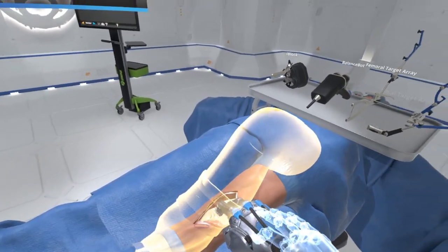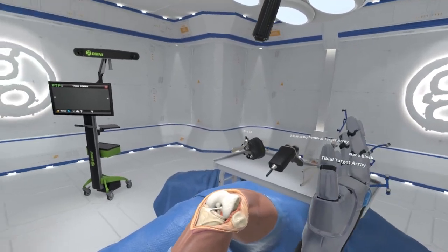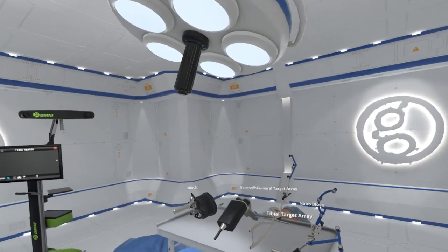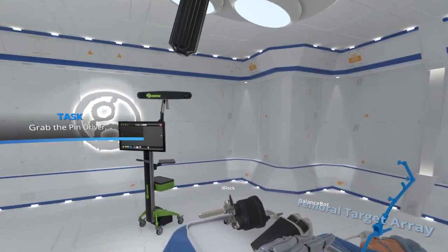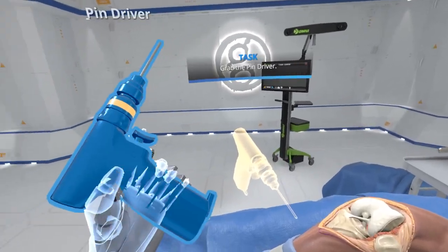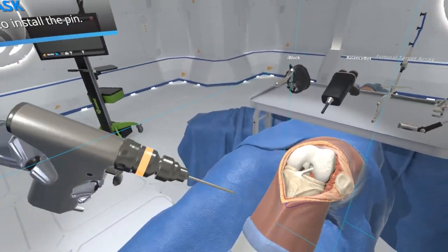Good, now manipulate the leg to reposition the knee into 90 degrees. The first pin is installed 4 finger widths below the incision site. Grab the pin driver. For this simulation the pin driver will have the necessary pin already loaded on the pin driver. Pull trigger to install the anchor pin and secure the tibial array to the anterior tibial cortex.